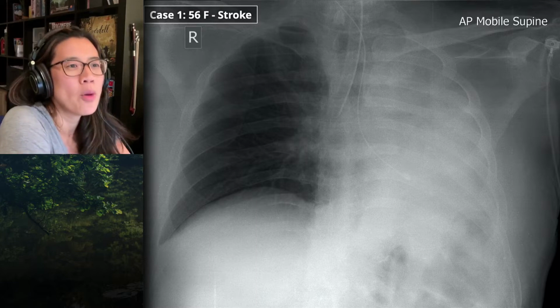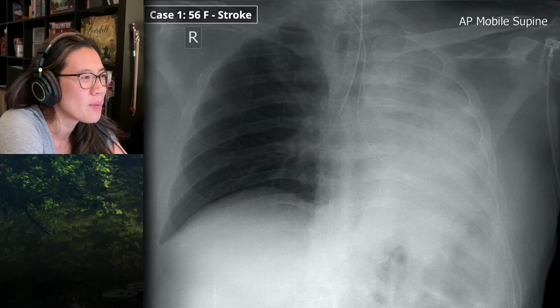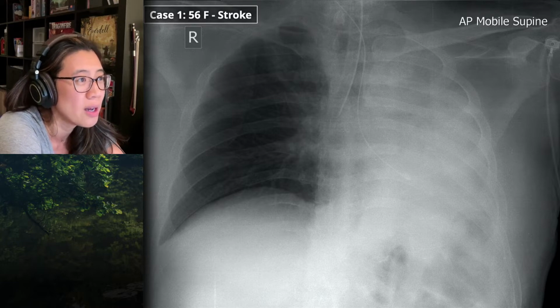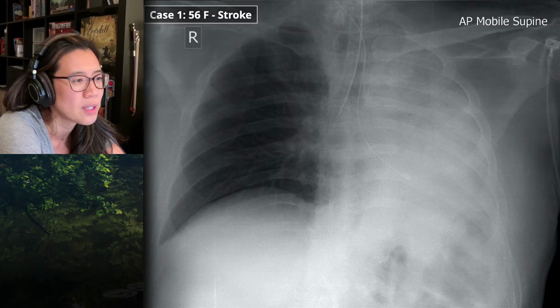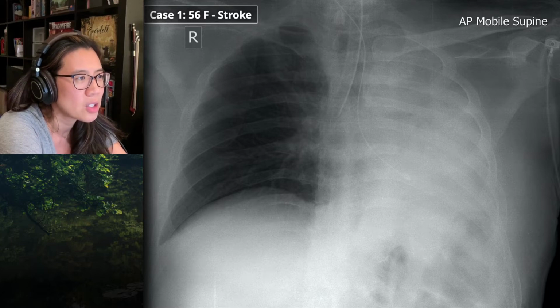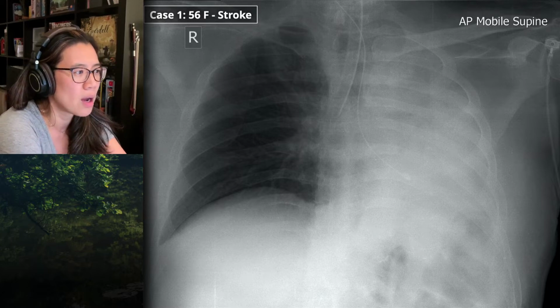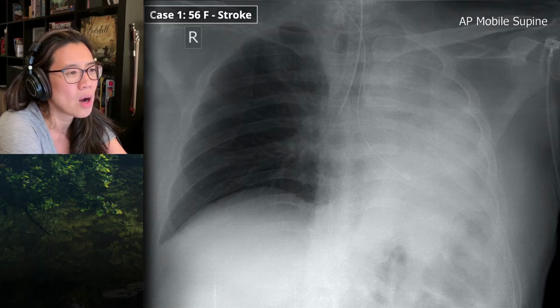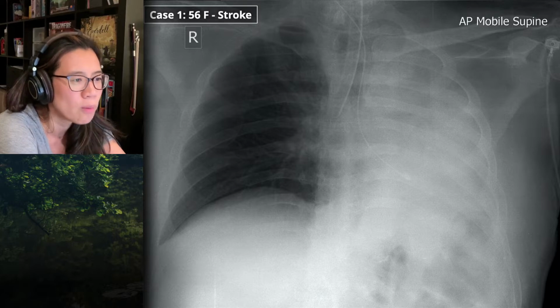Okay, so mobile supine X-ray in an adult female patient demonstrates that the patient is intubated with the tip of the ETT lying low within the trachea and a tube that projects from the centre superiorly towards the left side in what I would expect to be the left lower lobe bronchus. The tubes are associated with asymmetric density of the lungs, with the left lung being uniformly white or dense compared to the right side, which I think is normally aerated.